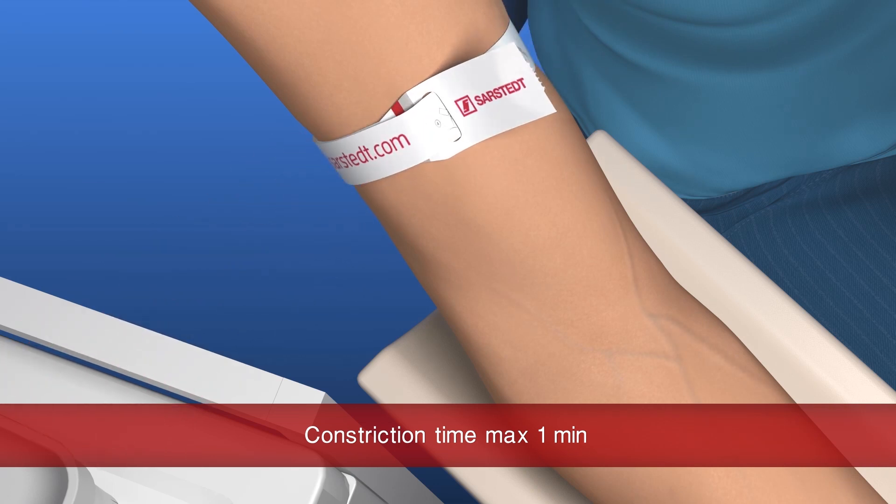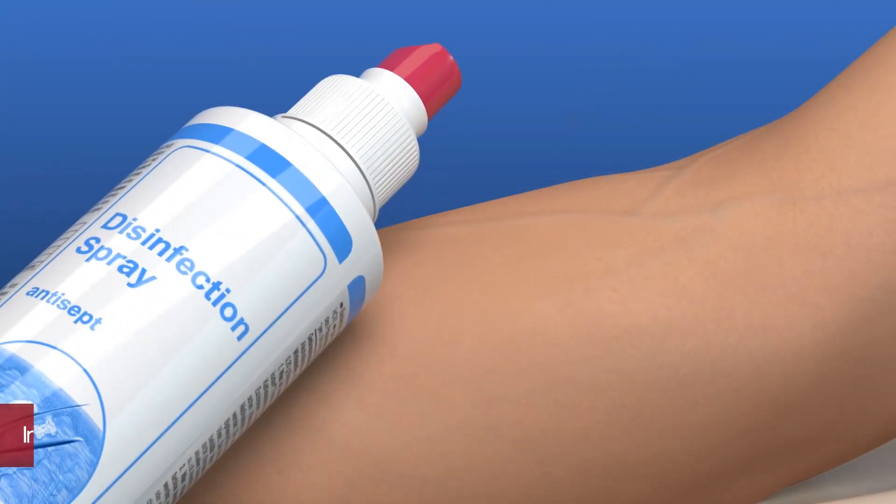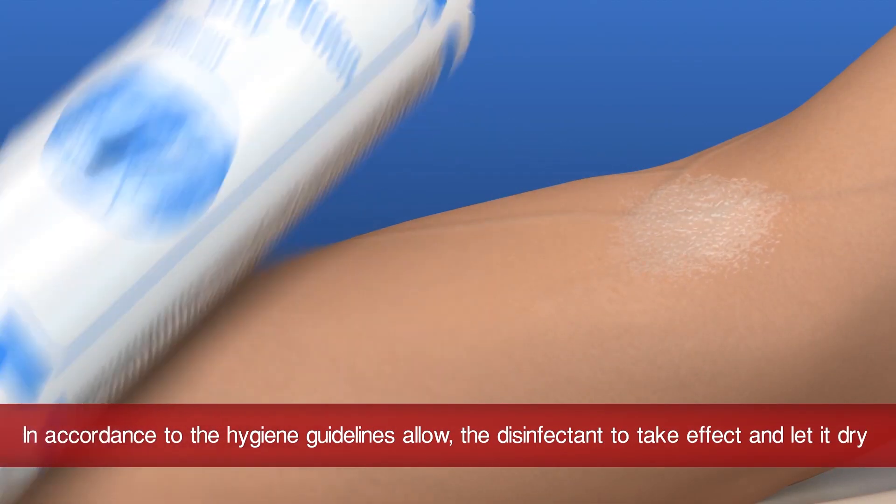Examine the veins and select a suitable vein. Disinfect the skin around the chosen puncture site.